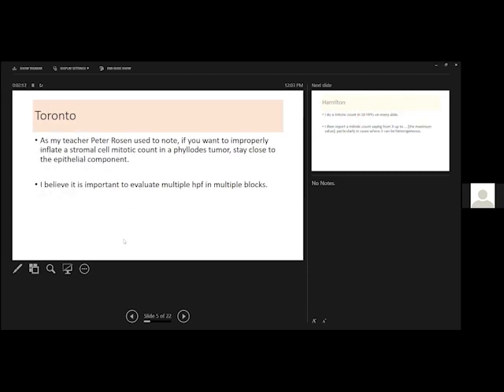I had 10 breast pathologists respond, all of them, and some of them from Canada. I will read some of those responses for you. For example, from Toronto, one of the breast pathologists wrote me, as my teacher, Peter Rosen, used to note, if you want to improperly inflate a stromal cell mitotic count in a phyllodes tumor, stay close to the epithelial component. I believe it is important to evaluate multiple high power fields in multiple blocks. So basically, this was against using hotspot.